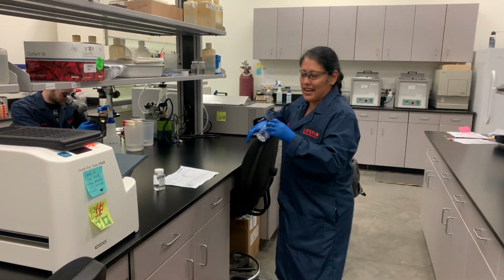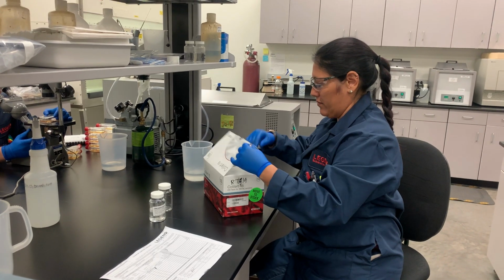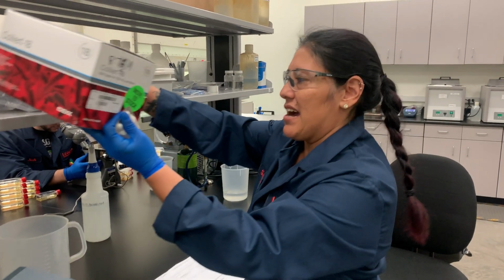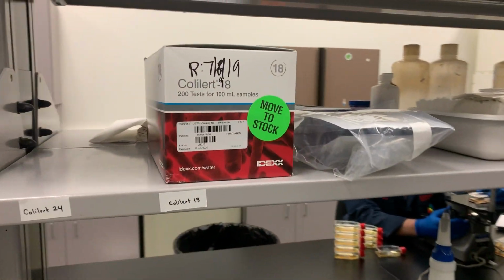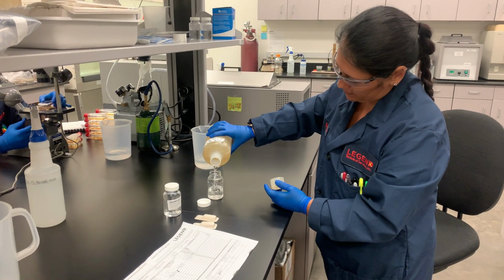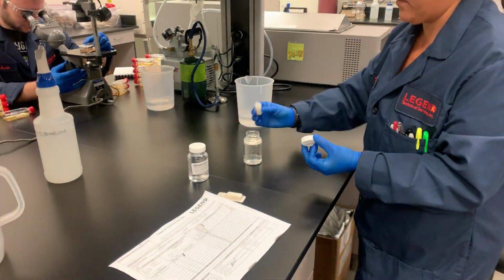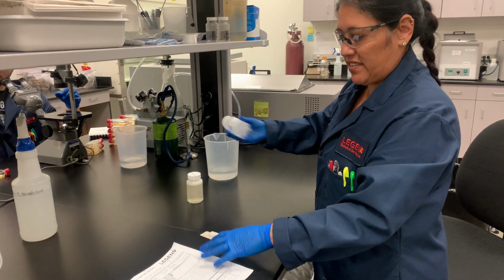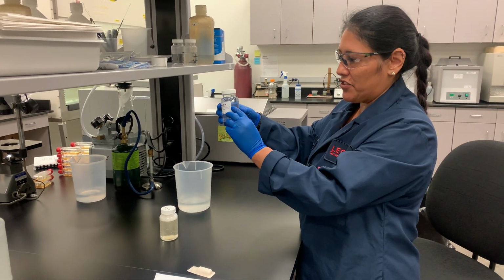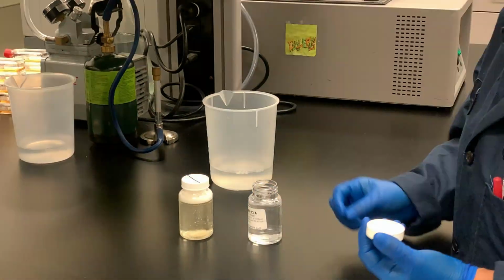So with the first batch of the day, we run a blank, which is just our sterile water. This is the color reagent that we use. It's an 18-hour. So we'll just add the reagent to the blank. And then for the sample, we'll make sure that it's homogenized. And then we want to pour it off to the 100 ml line. Add the reagent.